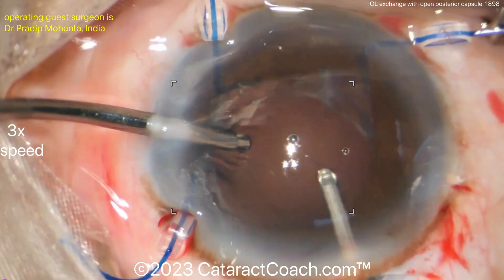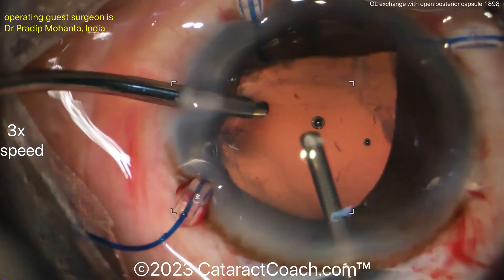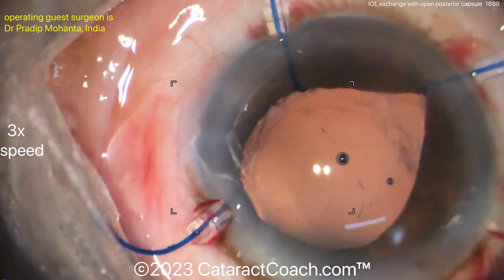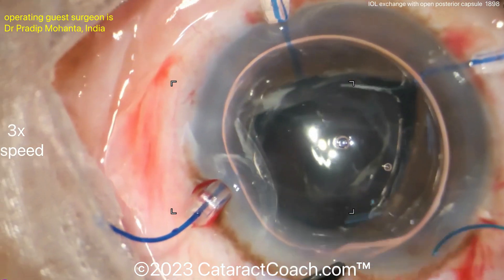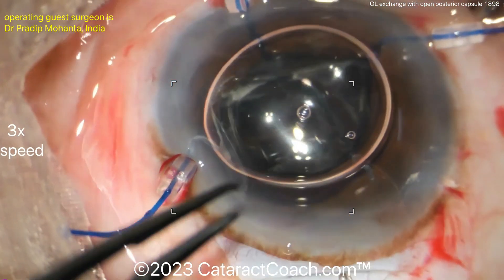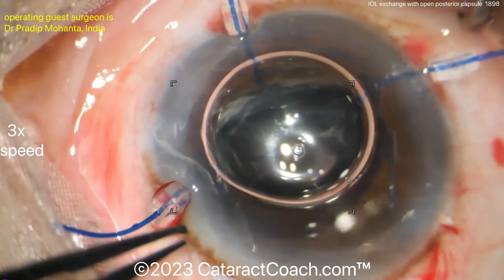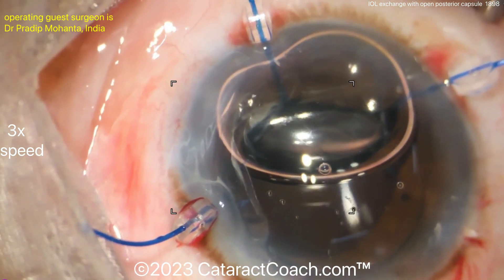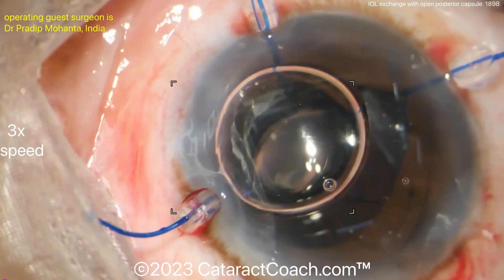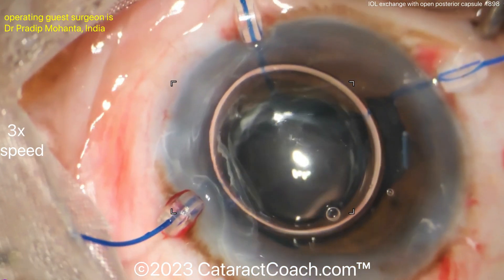The triamcinolone particles are caught in the outer surface of the vitreous, so take your time — a thorough anterior vitrectomy takes longer than you think. Switch hands to achieve full 360-degree coverage. An air bubble is also very helpful to confirm there is no more vitreous. Once the air bubble shows the anterior chamber is clear, a three-piece lens placed in the sulcus is a good option.